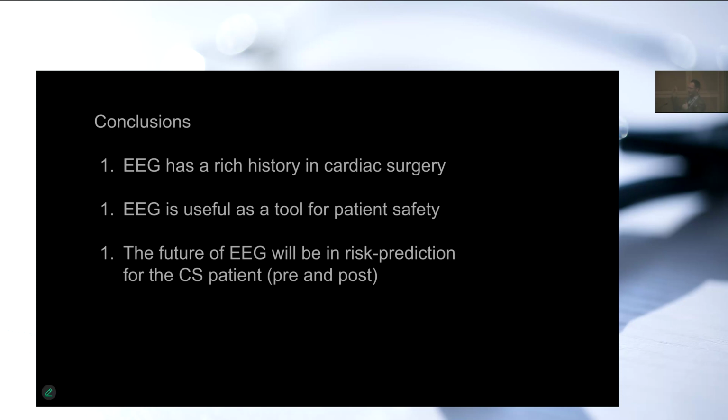So hopefully that study that's looking to optimize the alpha amplitude, which will also target burst suppression as a second metric, hopefully we can then say, well, if you intervene on it, then you modulate the risk or not. We'll see.